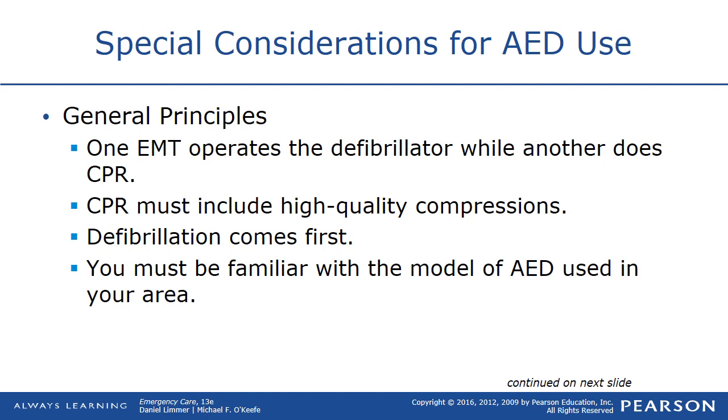Generally, this is how you use an AED in special circumstances. Most generally, one EMT operates the defibrillator while another one does CPR. CPR must include high quality compressions. Defibrillation comes first. You must be familiar with the model of AED used in your area.